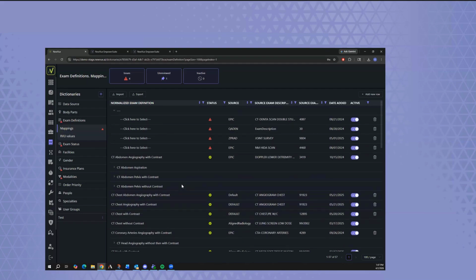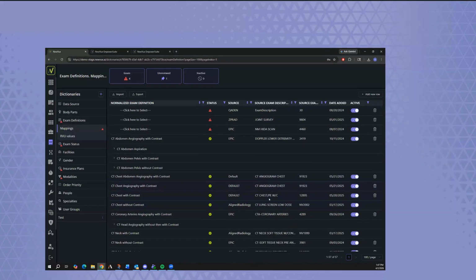So here, what we do is we use an AI normalization process on the wording of the procedure. So plain English, the name of the procedure as we process that. If we haven't already done an association to our normalized catalog, this is our normalization procedure, we use a combination of deterministic logic and LLM-based AI to select a normalized procedure from our catalog in order to standardize the configuration.